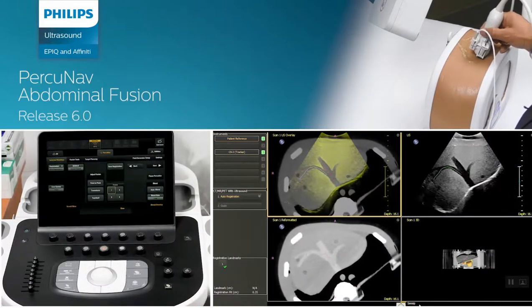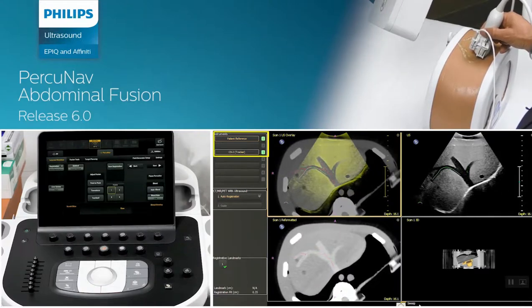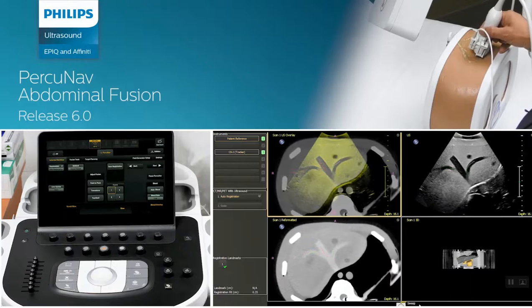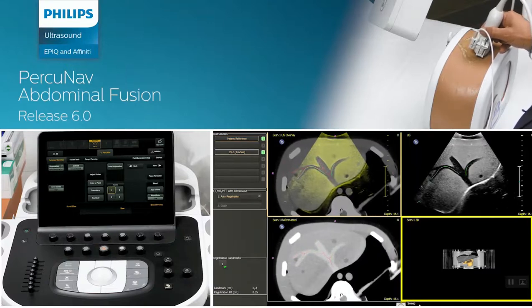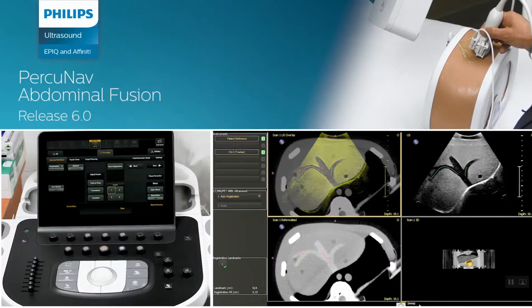During the sweep acquisition, ensure good electromagnetic tracking of the transducer and patient tracker. If the tracking is lost during part of the sweep, any vessel tree from the sweep could be compromised, resulting in poor registration. The system also displays the 3D view to assess vessel segmentation. The green lines are the segmentation from ultrasound, while the red lines are segmentation from CT.